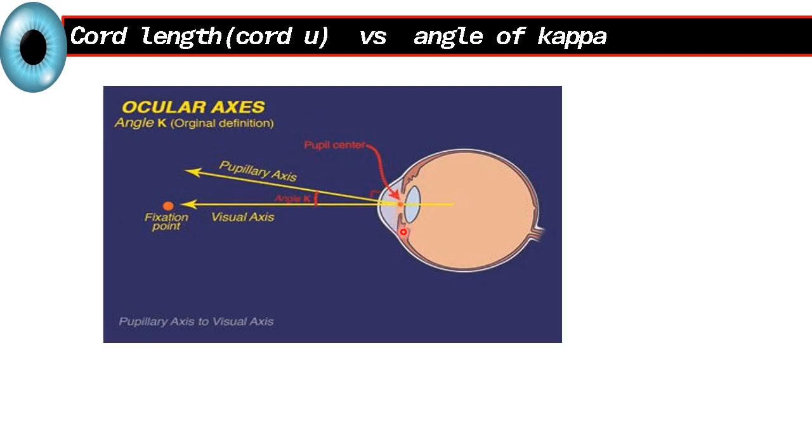However, those based on Placido discs, based on the reflection from the surface of the cornea, measure the virtual chord mu. This should be very well understood. So machines like LenStar optical biometry and any Placido disc-based topography, when they give the chord length, it is the virtual one, which is not the real one.